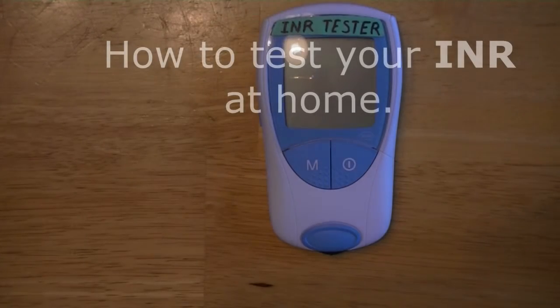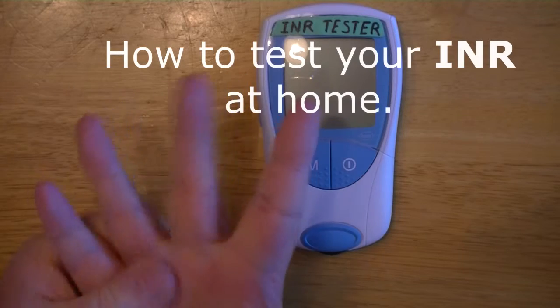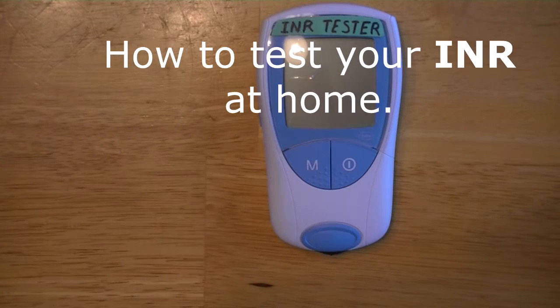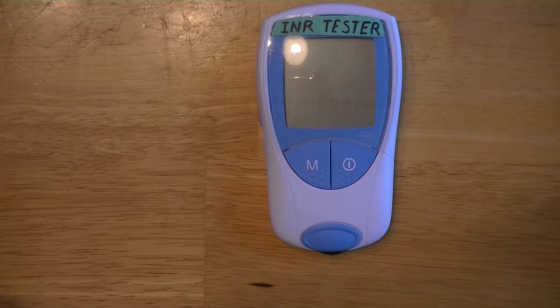The first thing you need to do when getting ready to test your INR is milk whatever finger you want to use — they recommend doing it like this. You also need to get your stuff ready, which is your meter, which is just an INR tester, so that we don't get in trouble for copyright infringement.